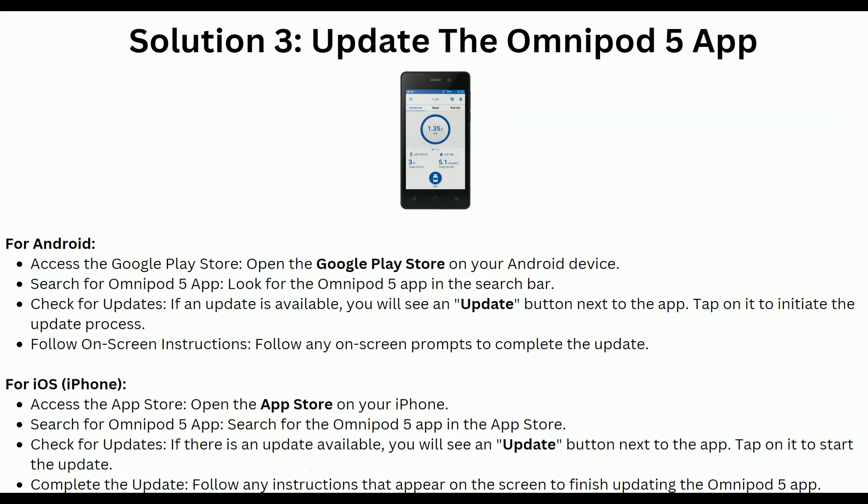Solution 3: Update the Omnipod 5 app. For Android users, open the Google Play Store on your Android device and search for the Omnipod 5 app. Check if any update is available — you will see an update button next to the app. Tap on it to initiate the update process and follow the on-screen instructions to complete the update.